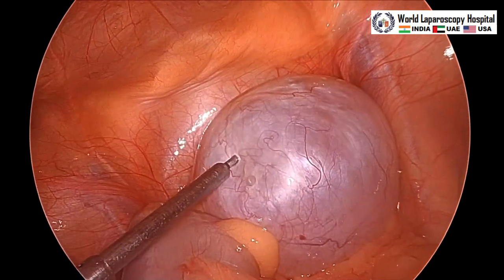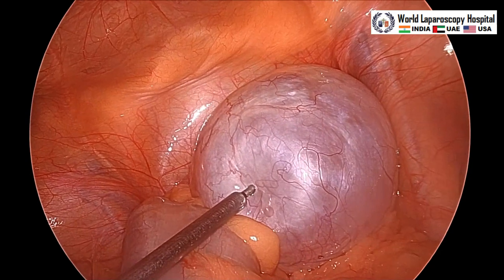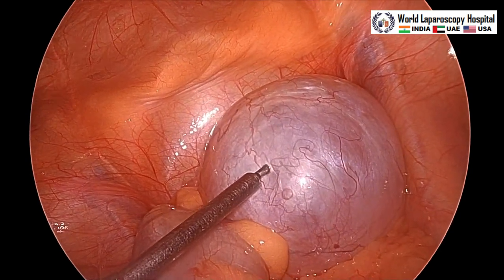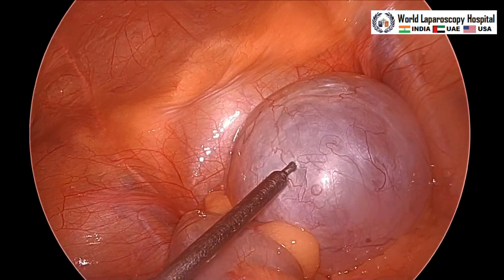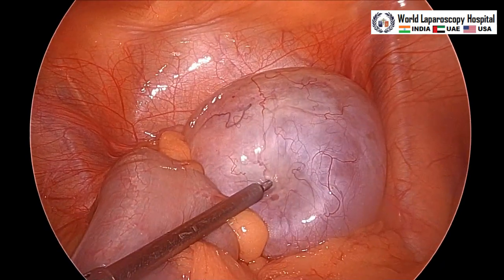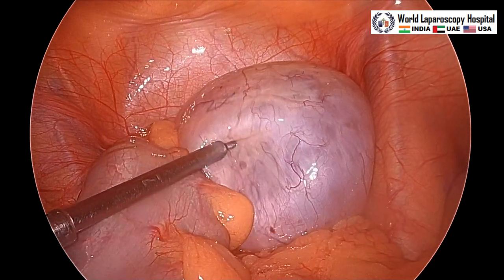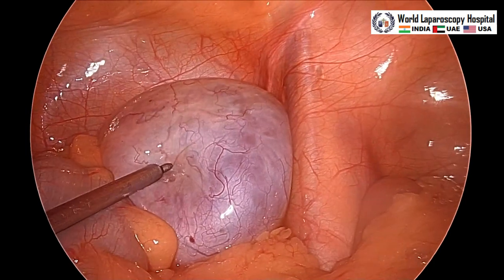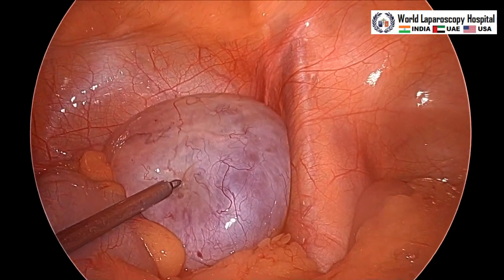This is the aspiration needle which is doing the aspiration of the ovarian cyst. This was a simple ovarian cyst confirmed by MRI, so we are not using any endo bag. If it would have been a dermoid or any endometrioma, then we would do it after putting it inside the endo bag.